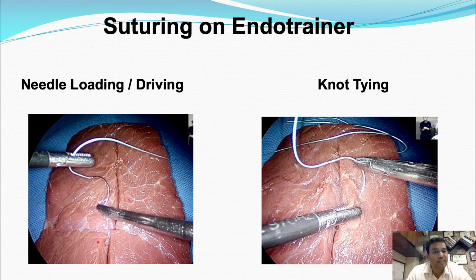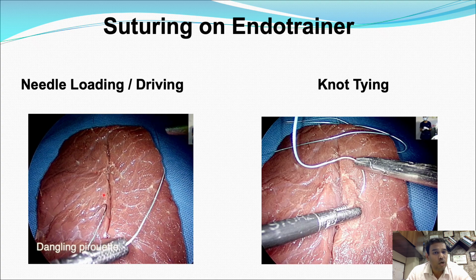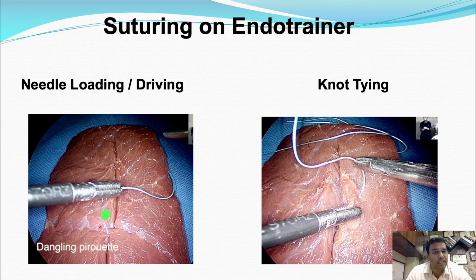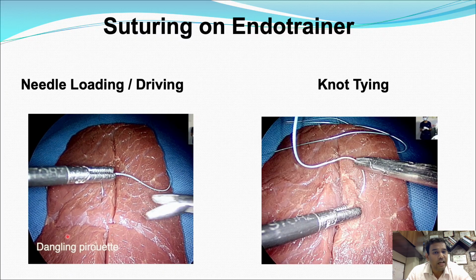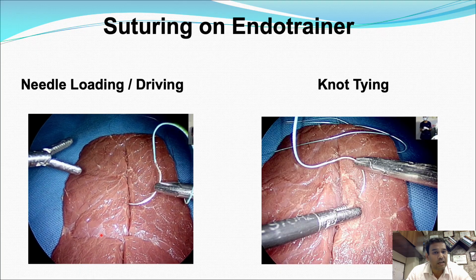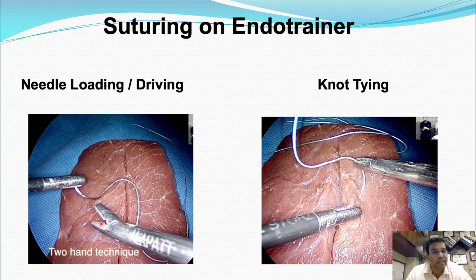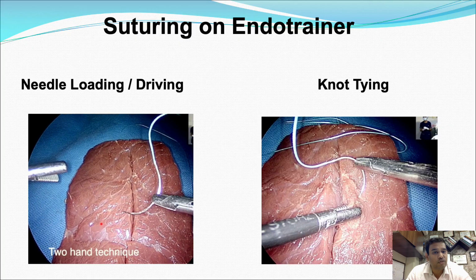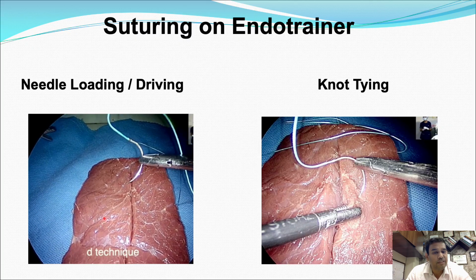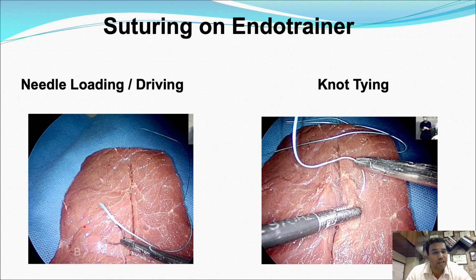Second technique is the dangling pirouette technique. You fix the tip of the needle holder over the tissue, hold the suture 2 to 3 centimeters away from the swage end and rotate, and once you find the proper position to hold the needle, you angle the needle. So now you can do the suturing. The third technique is the two hand technique, in which you can use the right and the left hand, and with the right and left hand you can manipulate and adjust the angle and accordingly you can suture.